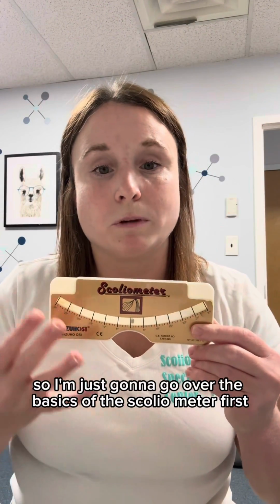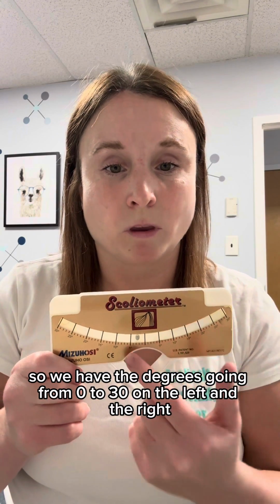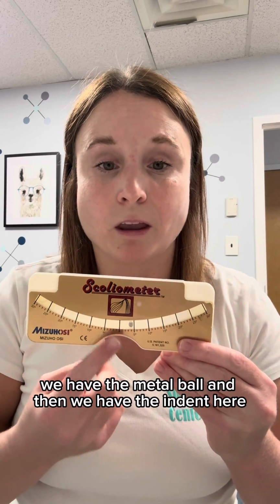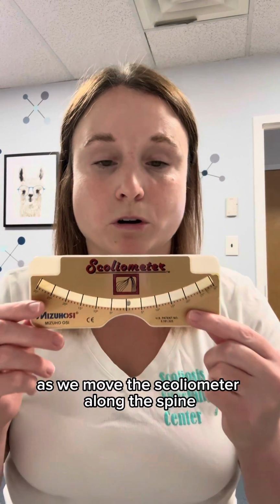So I'm just going to go over the basics of the scoliometer first. So we have the degrees going from 0 to 30 on the left and the right. We have the metal ball, and then we have the indent here. This indent is going to be going over the spinous processes as we move the scoliometer along the spine.